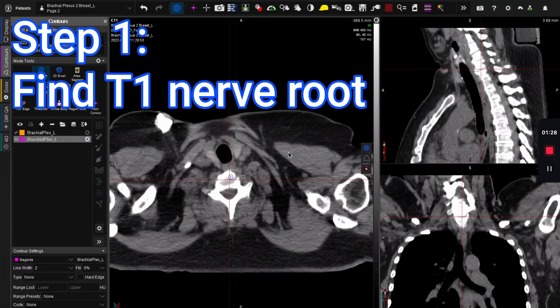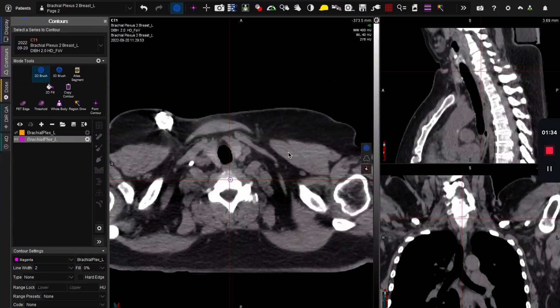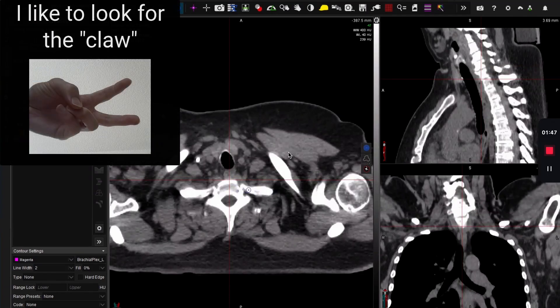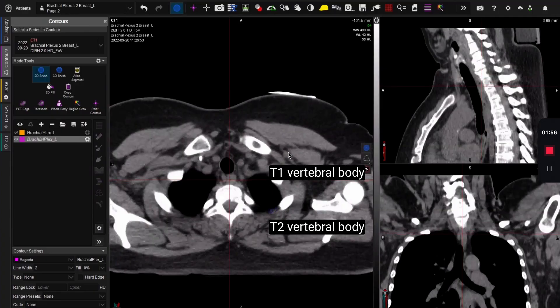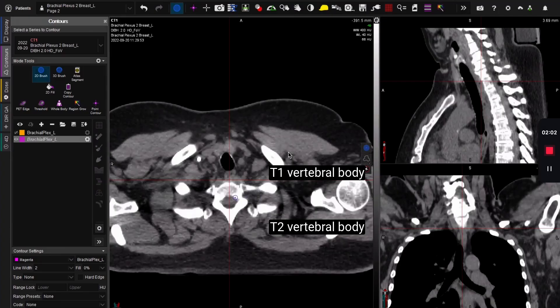So how do you find T1? T1 is below the T1 vertebral body — it's in between the T1 and T2 vertebral bodies. How can you tell when you're down to T1? It's where you have the first set of ribs coming off. So this is coming off the T1 vertebral body, and here's the second set of ribs coming off T2. All you have to do is find the space in between — that's where the money is, where you're looking for the T1 nerve root.